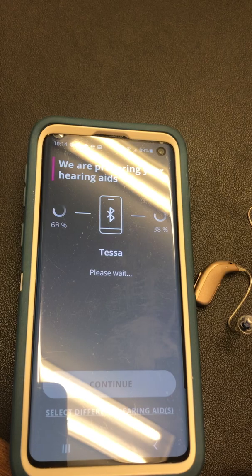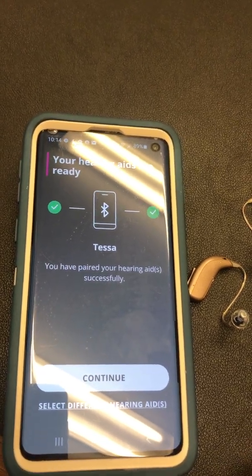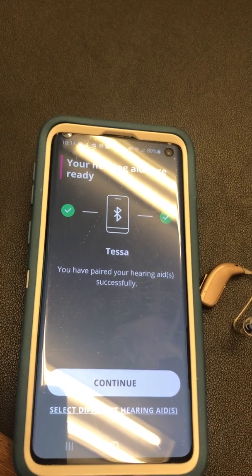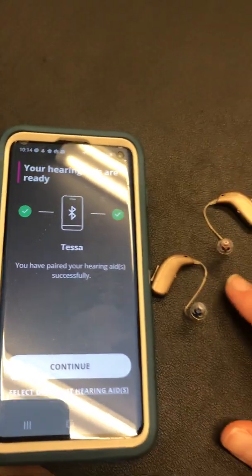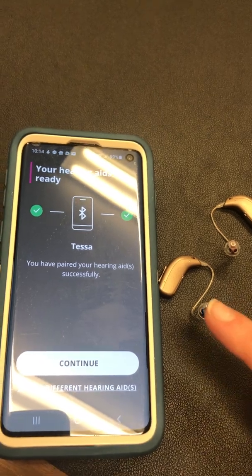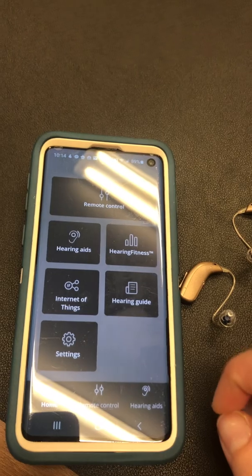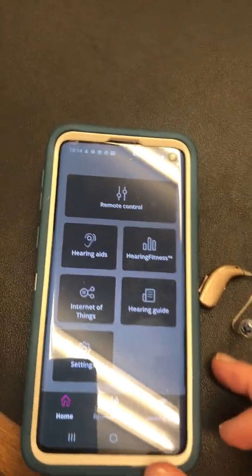Now we're going to pair. Both of your hearing aids are now successfully connected — it only finds the one because they are used as a pair. Once that comes up, you should have your pair successfully paired to your device. Push continue and here is your app.